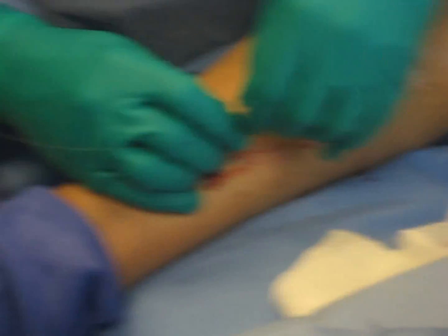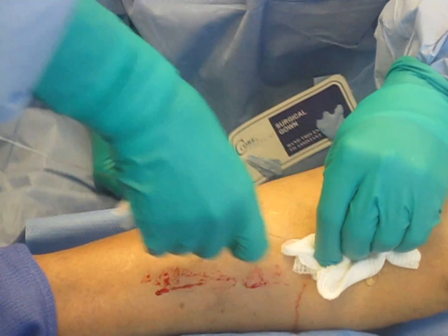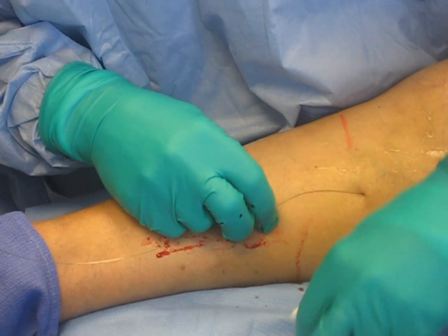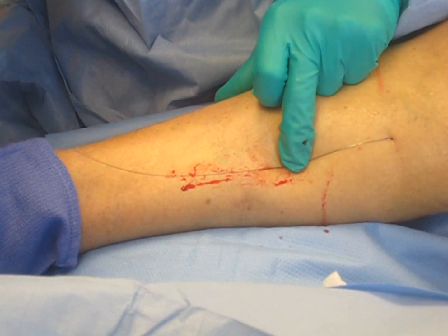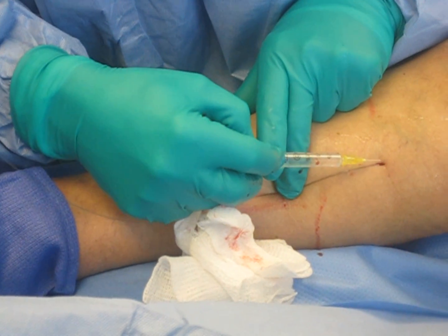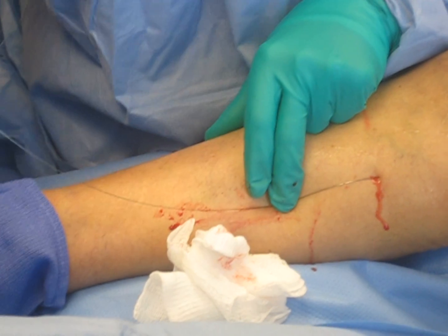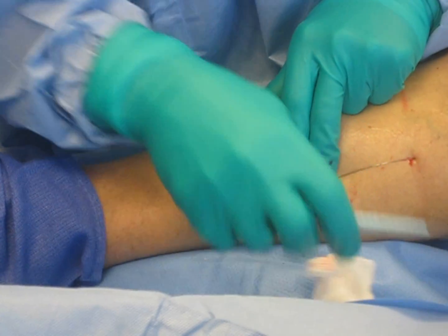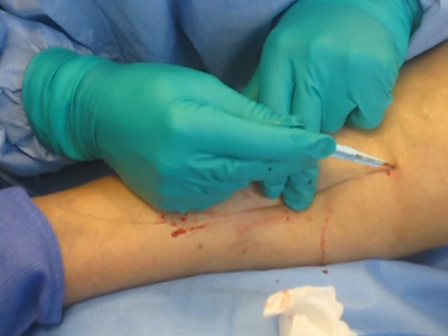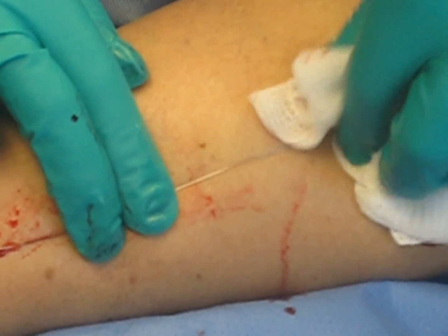Our next step is to take our access needle off this guide wire. Then I'm going to numb up her skin a little bit more and do a little tiny skin nick right here — just open this skin just a tiny bit. You're pretty surprised how little discomfort there is. There we go.